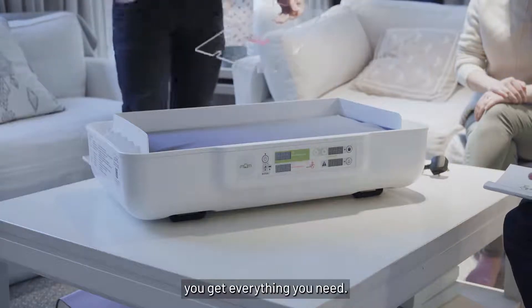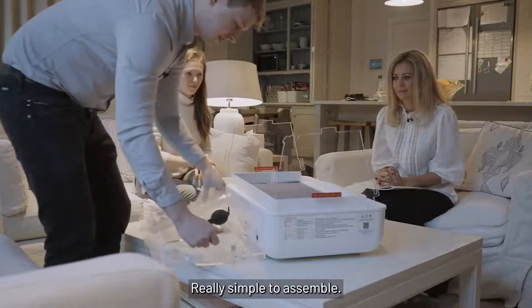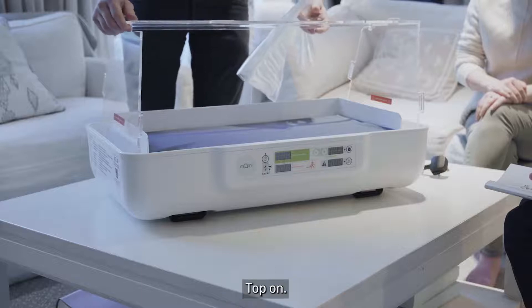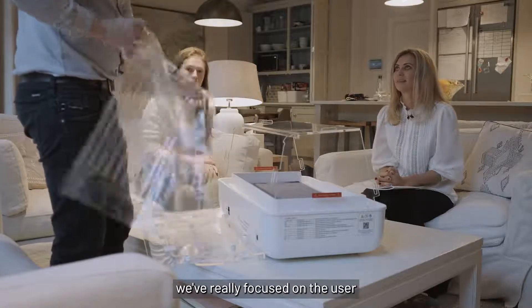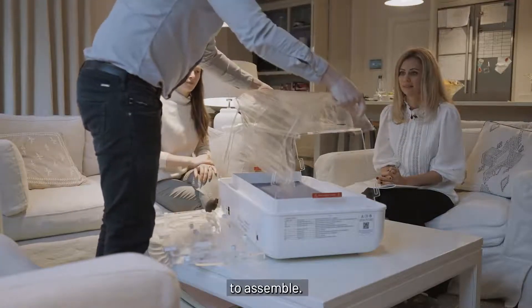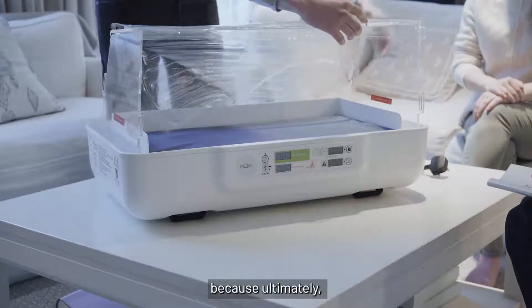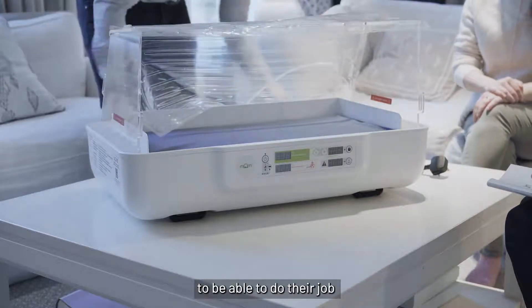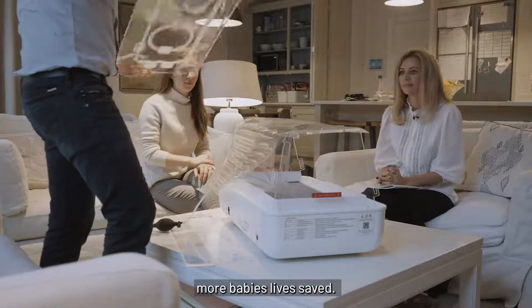The main base unit — you get everything you need, really simple to assemble. Side panels in, put the top on. Ever since the start of designing this, we've really focused on the user and how easy it is for them to assemble. We've had a lot of testing on how this is used by clinicians, because ultimately if they can use this system simply, they're going to be able to do their job more effectively — and that hopefully means more babies' lives saved.